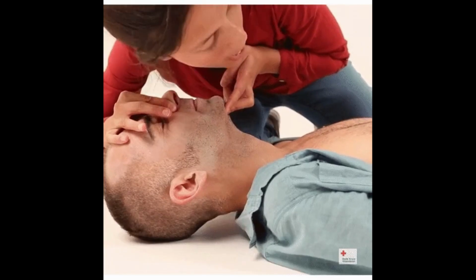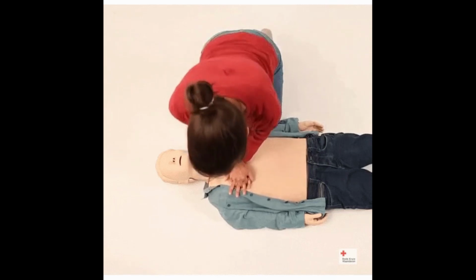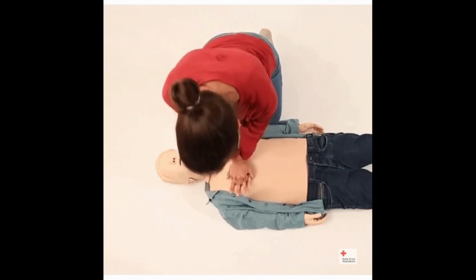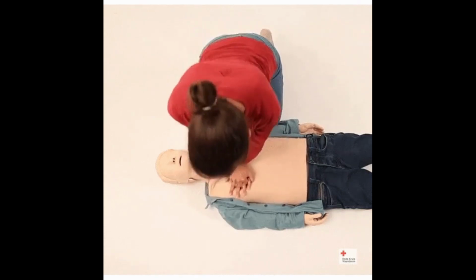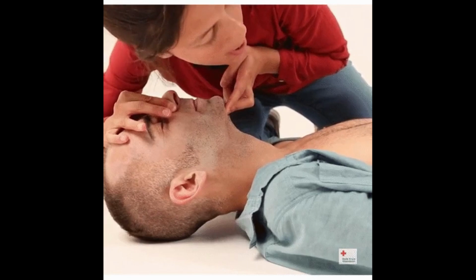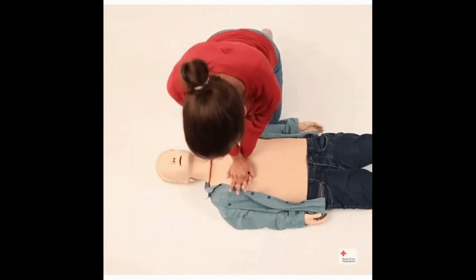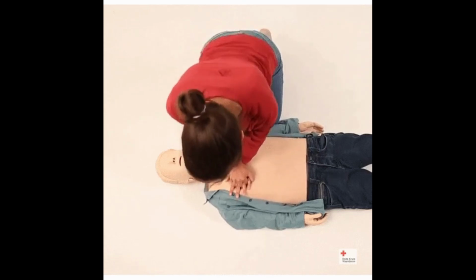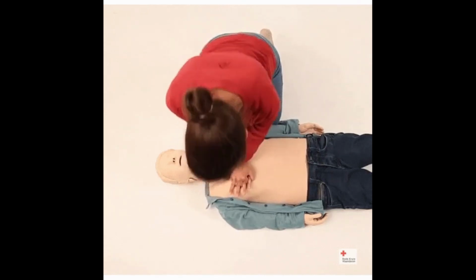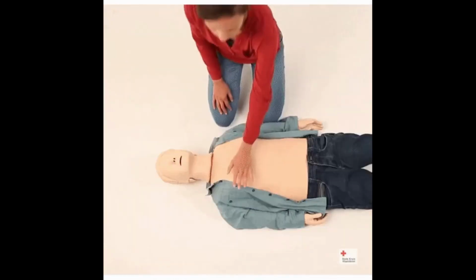4. Start CPR. If you are not there alone, you should start giving CPR while the other person is getting the automated external defibrillator. If you are alone, call 911, then start CPR. Give 30 chest compressions and then 2 rescue breaths for every 30 chest compressions. The rescue breaths should be no longer than 1 second. Avoid overventilation and only provide enough air to see the chest expand.